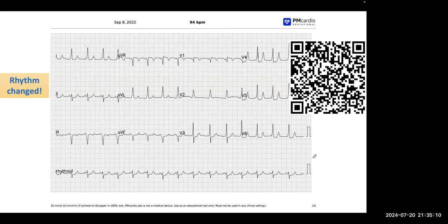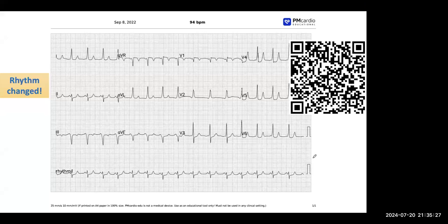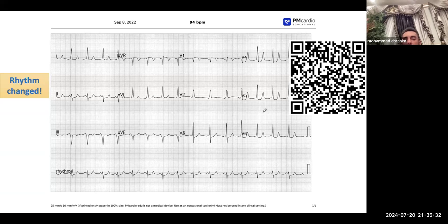So the tachycardia terminated, and there is a delta wave. Short PR, delta wave. Yes, but there's a short PR delta wave. In retrospect, the patient does have WPW, we know, and was in AFib.